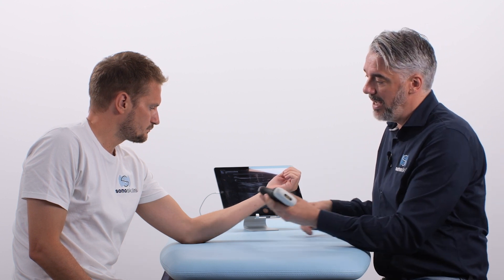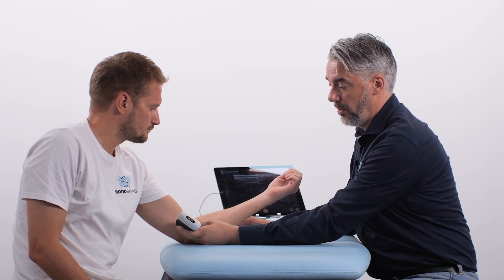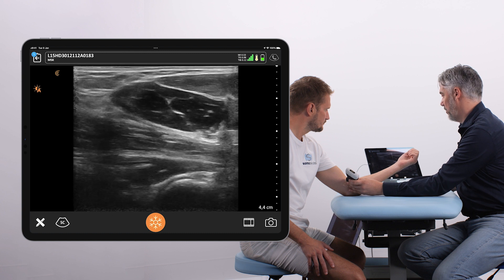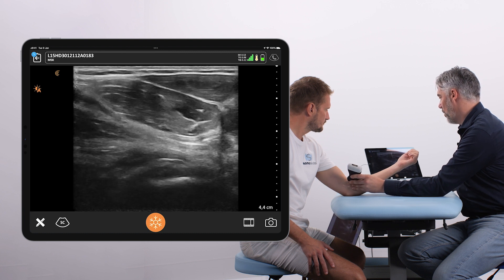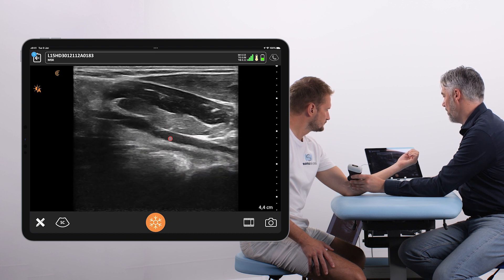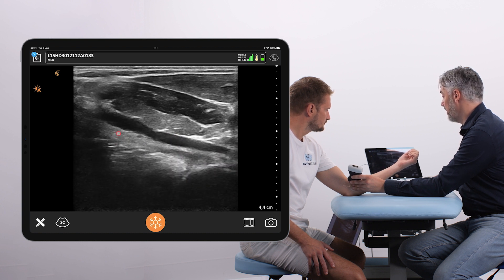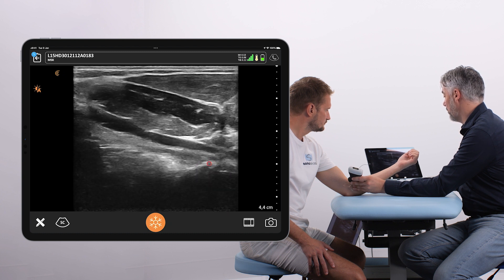The transducer is going to be placed in line with the humeral bone, and we're going to start right here. Then we're going to move the transducer distal and somewhat ventral. We look for the brachial artery as a landmark. The distal bicep tendon is underneath, inserting to the radial tuberosity bone.